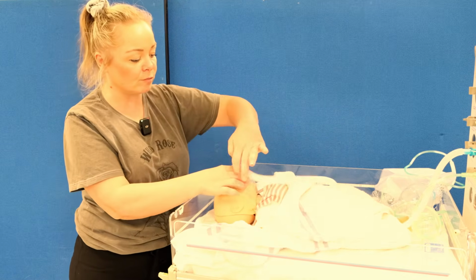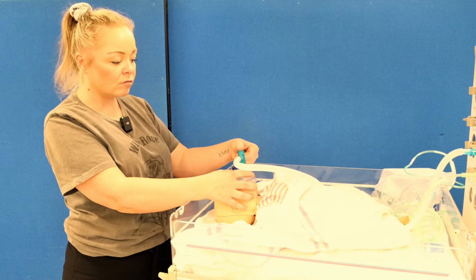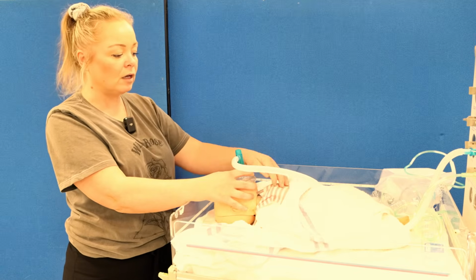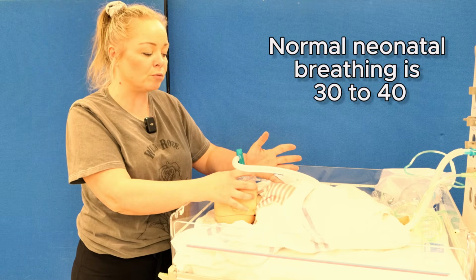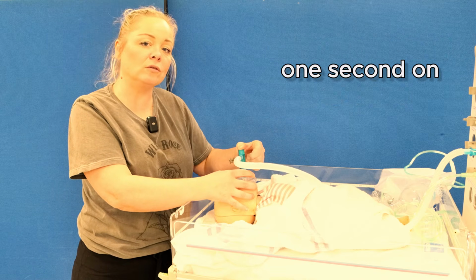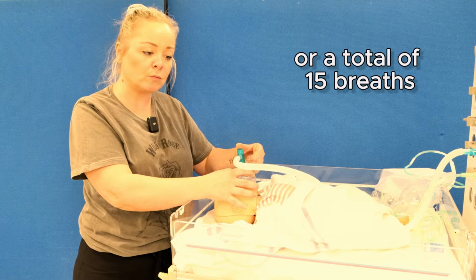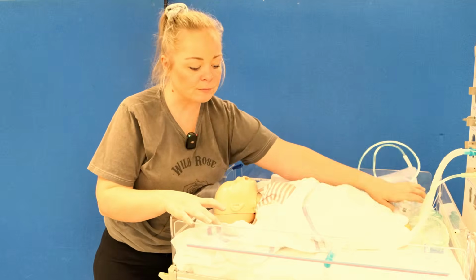And then when we're doing ventilation breaths, it would be 1 and 2 and 3 and... But 1 second in, allow that gas to exchange, 1 second off. We don't want to go 1, 2, 3, 4. Allow the baby to breathe at a normal rate, what they normally would. So the normal neonatal breathing is 30 to 40, so if you make it easy, if you do 30, it's 1 second on, 1 second off. And you do that for 30 seconds or a total of 15 breaths, whether you use the TPs or you use the bag valve mask.